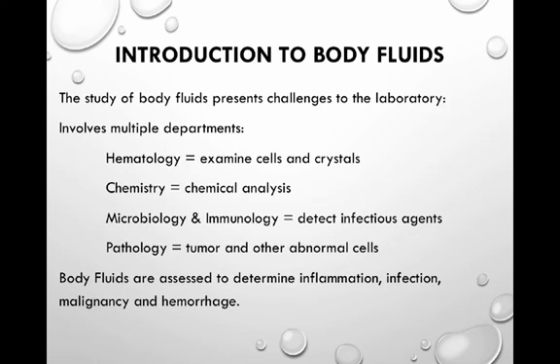Because of this, it presents a challenge to the laboratory and sometimes involves multiple departments when we talk about body fluid analysis. Hematology is our end of the deal, looking for cells or crystals. Some of the other departments like microbiology will look for bacteria or other infectious agents. Chemistry will do chemistry analysis, looking at glucose levels or protein levels.